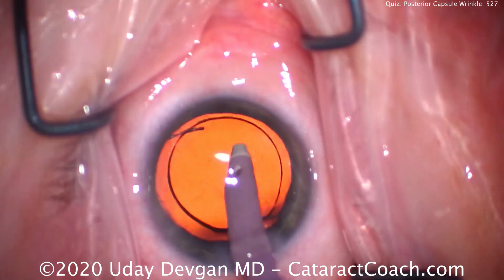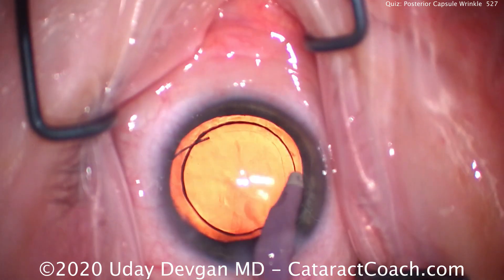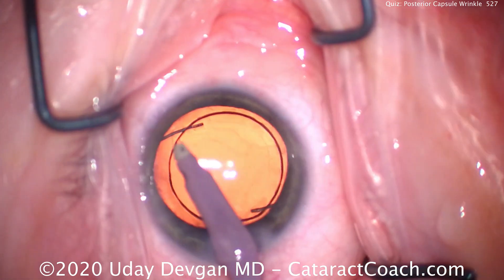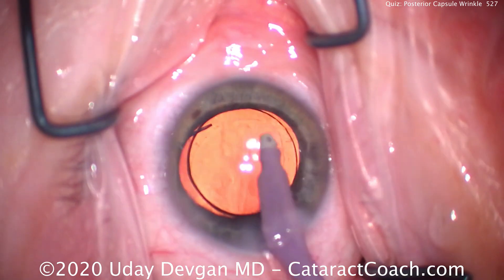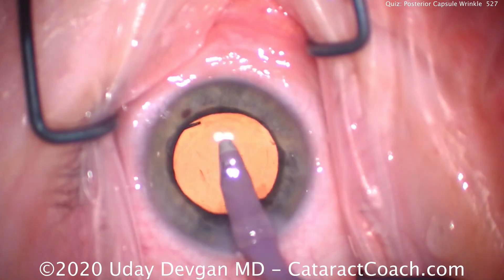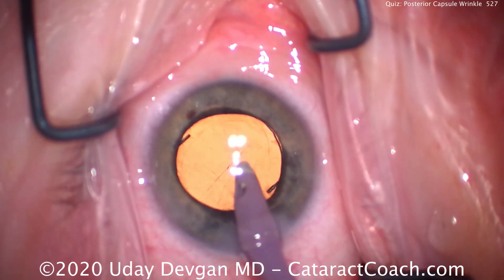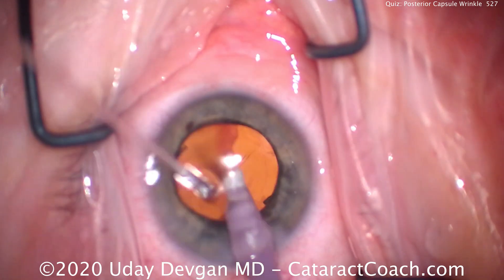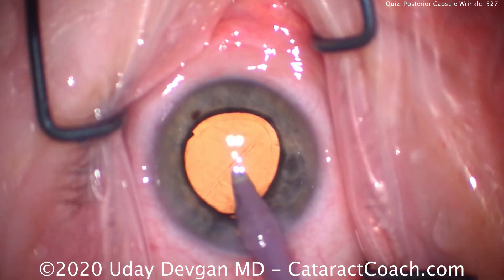That looks great — re-centering the lens. Still looks beautiful, nicely centered in the capsular bag. Let's remove the rest of the viscoelastic. You can even see there's a good overlap of that 5mm capsular rexis on top of that 6mm optic. The orientation of the haptics is fine. This looks all pretty good — and I think we're home free, right? Look carefully — you see a little bit of that wrinkle already developing?